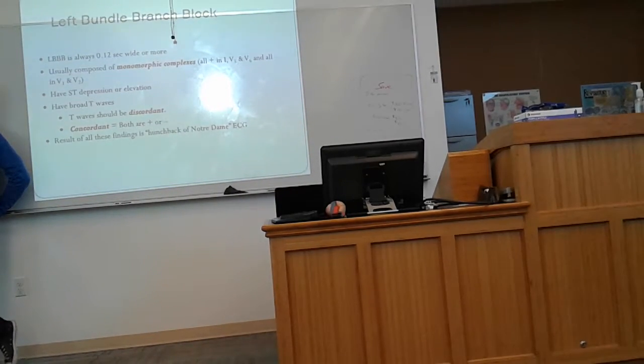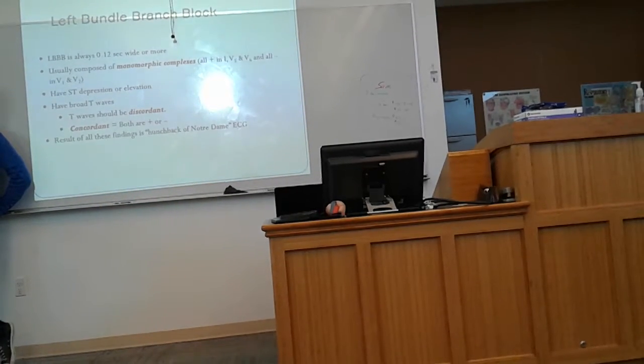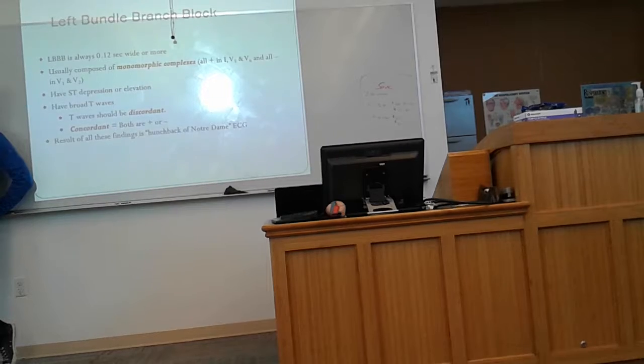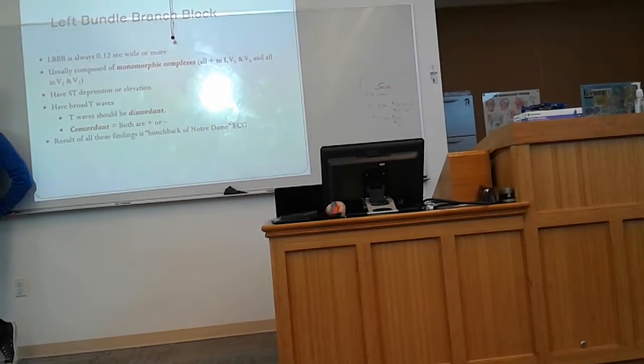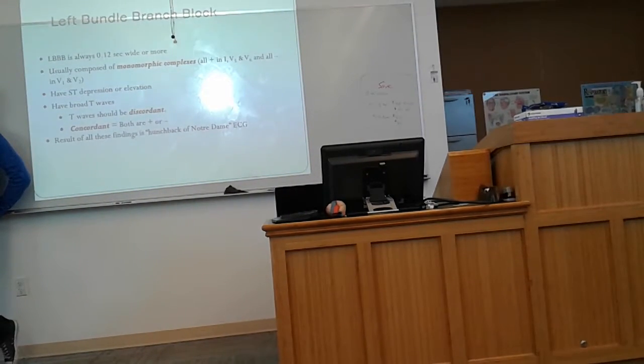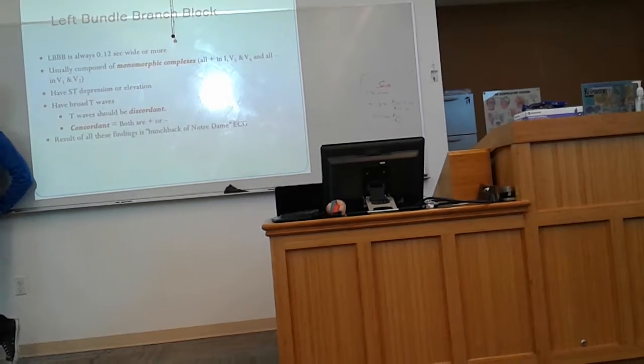Away from it. Great. And what's happening on the right side? It's still depolarizing, but there's more happening on the left. Great. And then what's happening in the other leads? Depolarizing. Yes. What's happening in leads 1 and V6? All the electrical activity is happening on the left side. What direction to them? Down, towards it. Wait, did you say V1 and V6? I said lead 1 and V6. Okay, thank you.